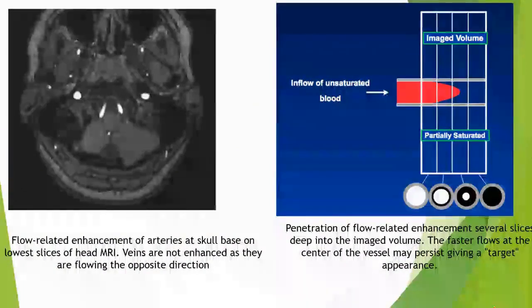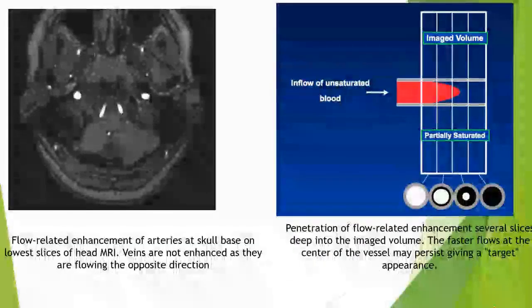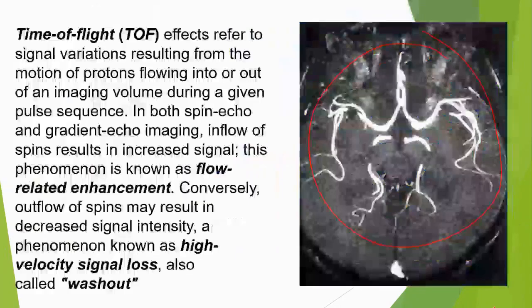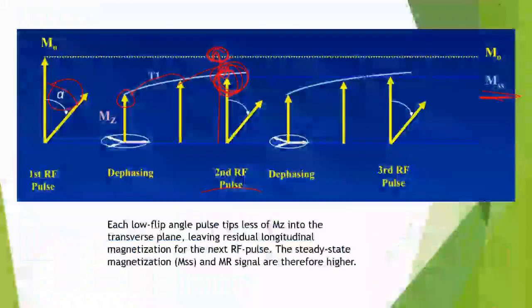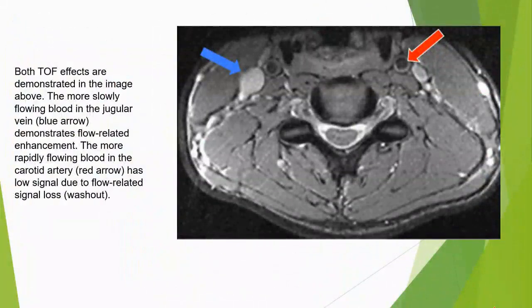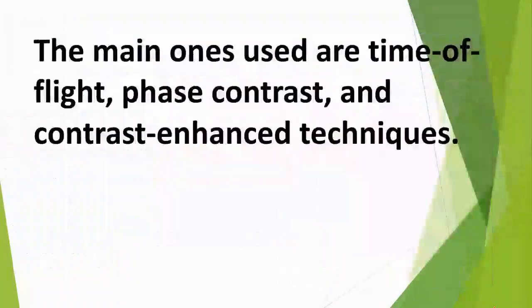So, regarding the MRI topic, you completely comprehend how the image works and how things are going with the time of flight and the spin echo or flow void, and these things are clear for you in great detail and thoroughly. The point I want to make is that we are supposed to, in a comprehensive manner.